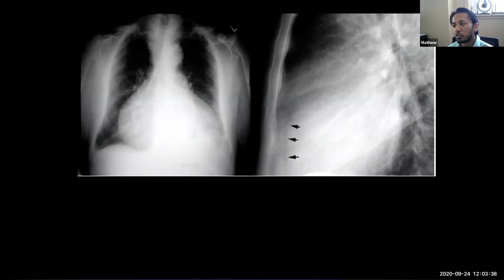These are the type of chest x-rays you're going to see on your boards, because they don't want there to be any type of suspicion or any question about it. Those questions that they write go through so much vetting that they don't want there to be any chance that it could be misinterpreted as something else. But when you look on the lateral, you can see this positive radiographic sign with the arrows, right? So you can see this clear lucency.